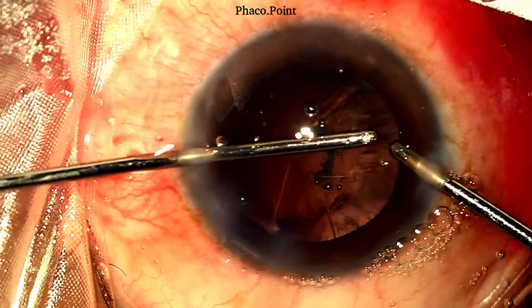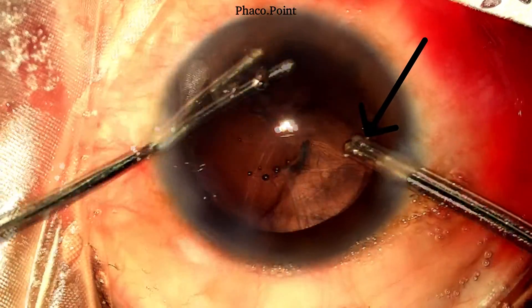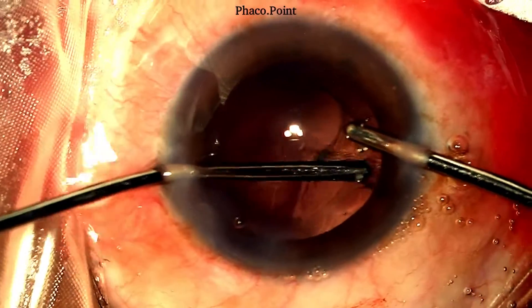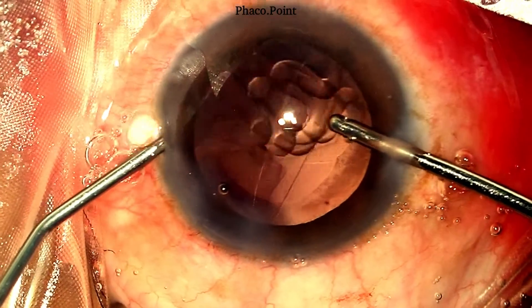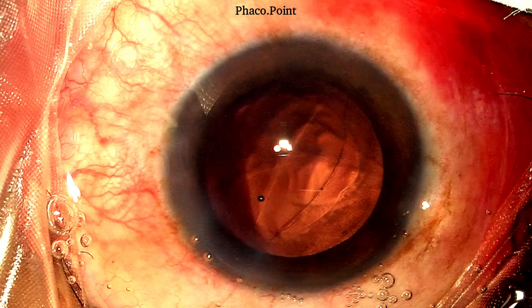With care and caution, the rest of the cortex is removed. The irrigation port should always be facing the angle — this prevents the vitreous from getting hydrated and further reduces the chances of vitreous prolapse. With care and caution, I'm able to complete the cortex removal, after which a dispersive viscoelastic is used to perform a visco fluid exchange. Despite noticing a rent halfway through the bimanual irrigation aspiration, without disturbing any of the vitreous, we were able to remove the entire cortex.